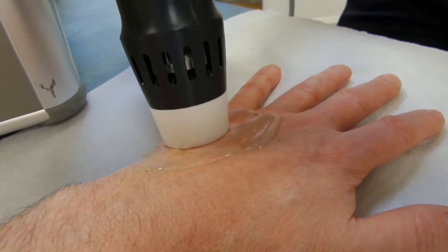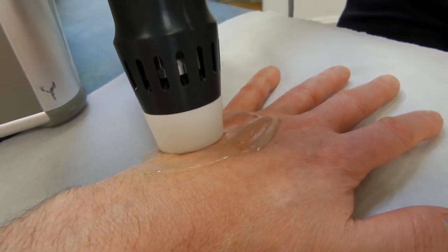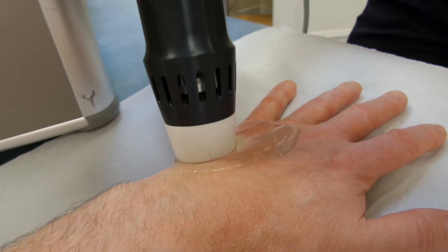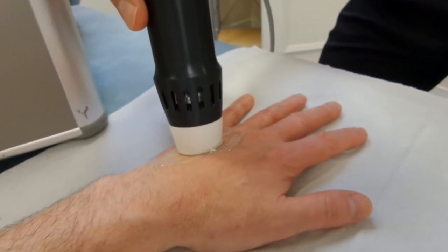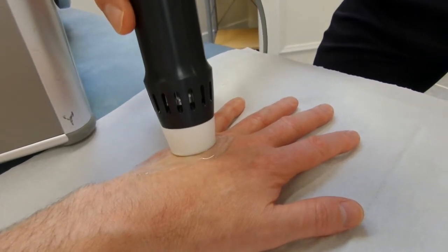Obviously if you were doing an Achilles tendon or a bony heel spur, you would probably just pick an area and focus on that area. Although that does tend to be quite painful and in fact can be damaging to the skin.